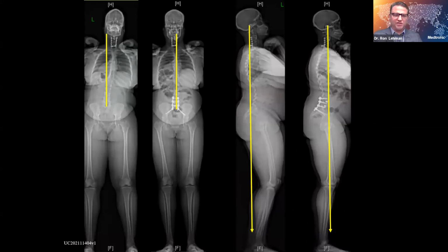So in these type of situations, with robotic assistance, we do a L4 to the ilium, decompression at 4-5, 5-1, and then 20-degree lordotic implants at 4-5 and 5-1, and adding the S2 AI screws to help with additional fixation. One, because she had a kyphotic segment to start out, and 2 is that her BMI is a little bit higher, and so she's going to require more in terms of mechanical stability.